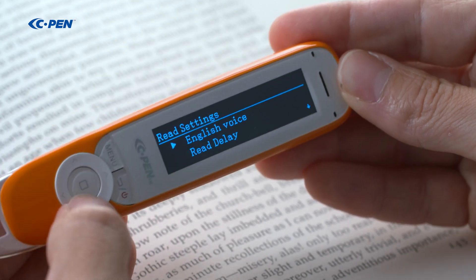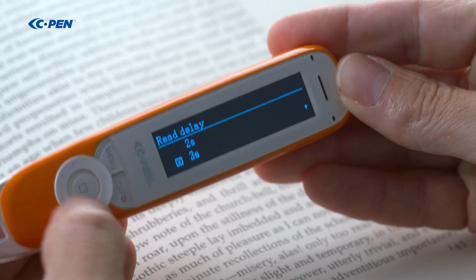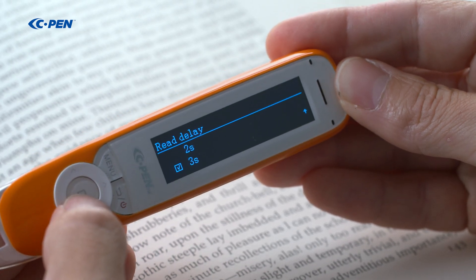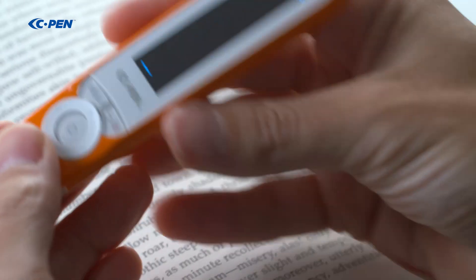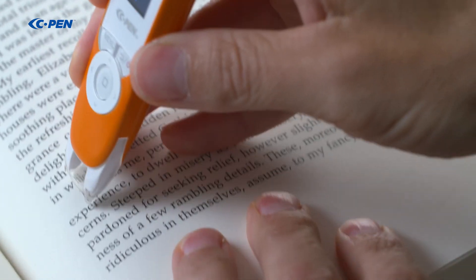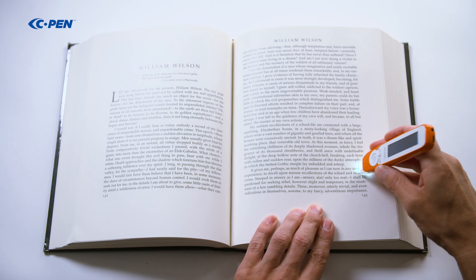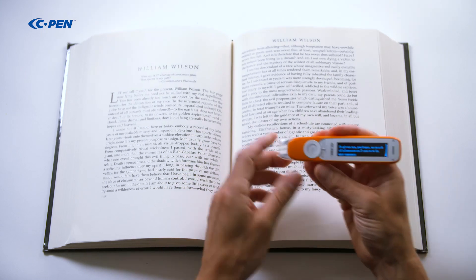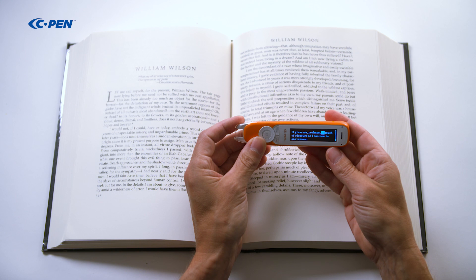Read delay adds an extra pause after scanning and allows you some extra time to shift focus from scanning to reading.